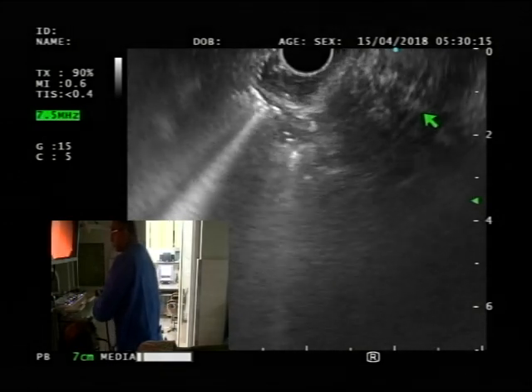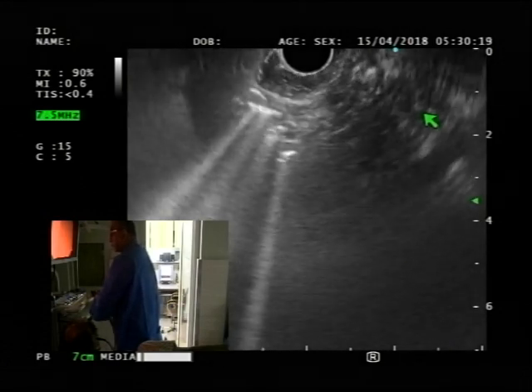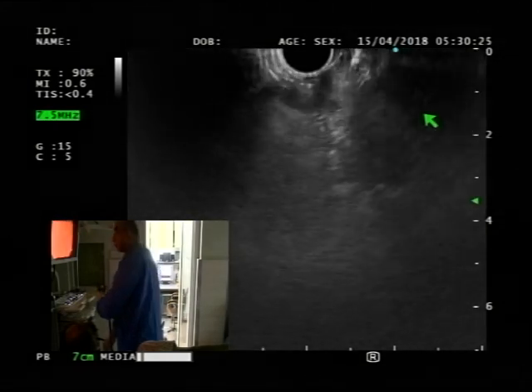I just wanted to show that the third one from yesterday was very bloody too. We'll see. Is it very vascular? Maybe, yeah, I'll see. But I think we'll have it in the final. These are lymph nodes. Yeah, these are lymphoid cells.